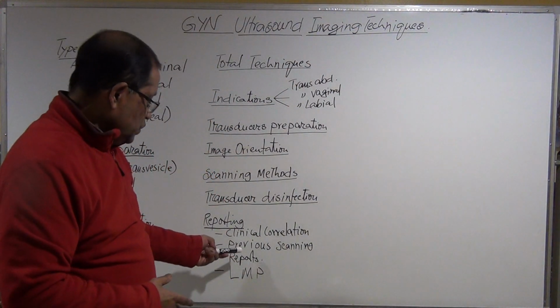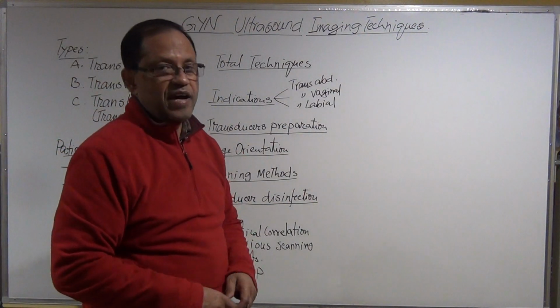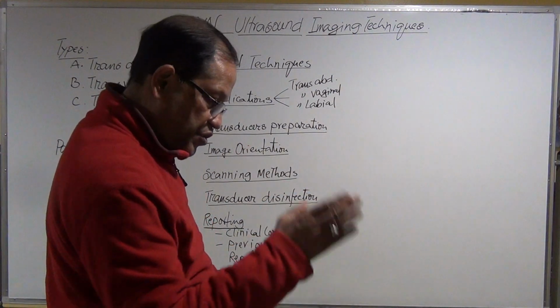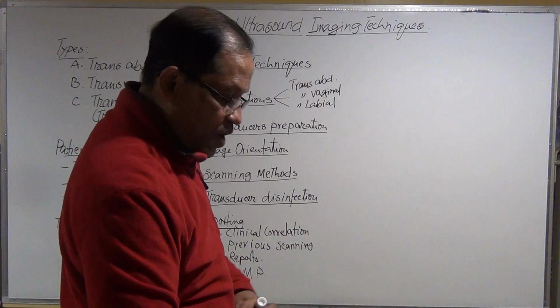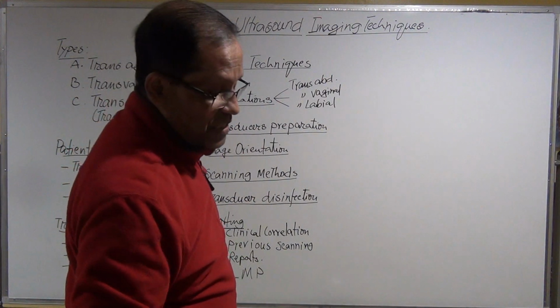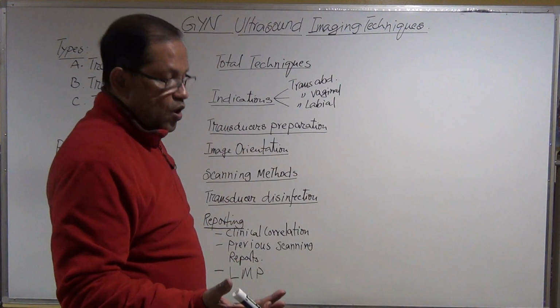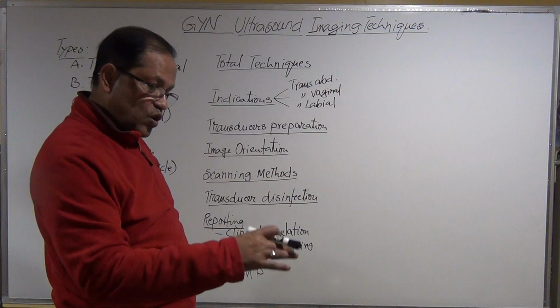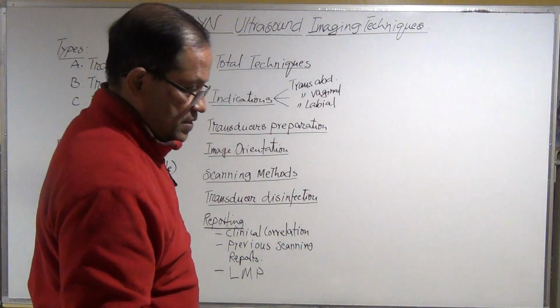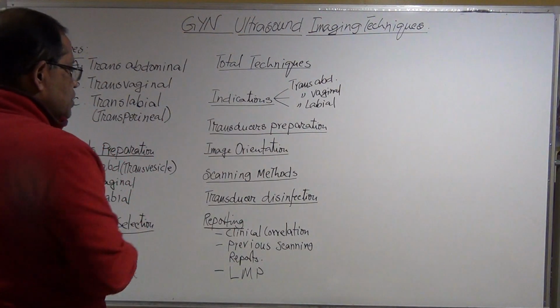And we have to indicate whether there is any previous scanning report in the patient file. So we need to check the patient file or folder. You need to check whether any other modalities were done for this patient, when it was done, and what the report was. And you have to compare your report, because the protocol is done the same, and now you have to compare your findings with the previous findings.